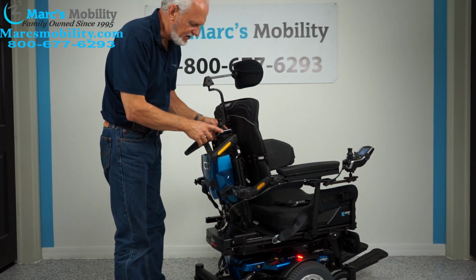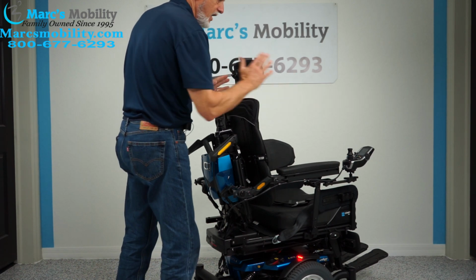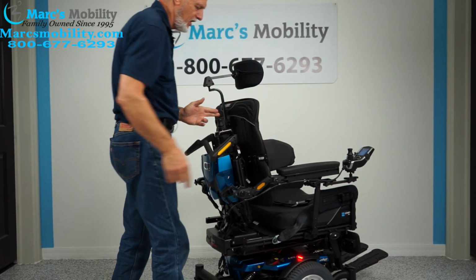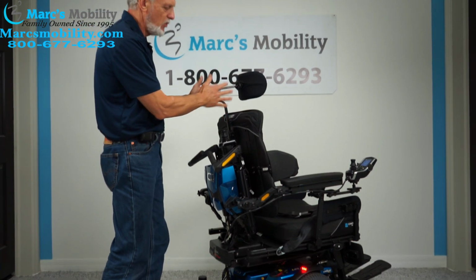When you're done using the attendant control, hit the button again, and then turn your power back up front, because you'll never have 2 drivers. You're gonna drive here or you're gonna drive there. Now we have the control back up front. This one does not work, and this one works now, okay? You have a fully adjustable, removable headrest.